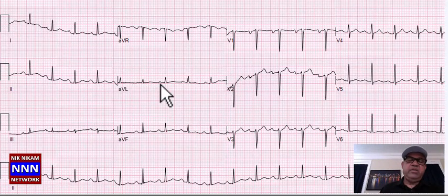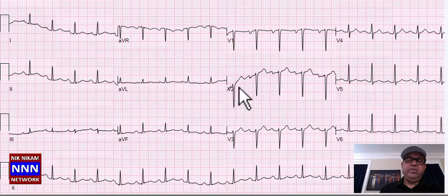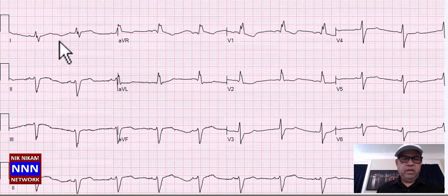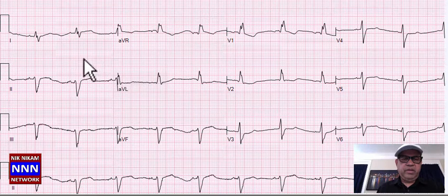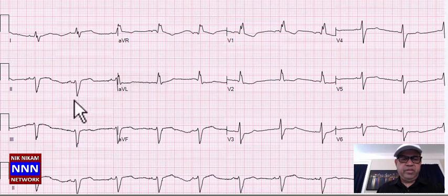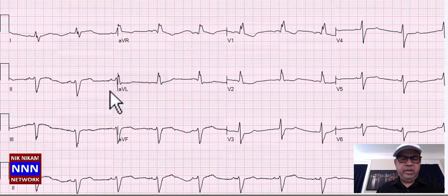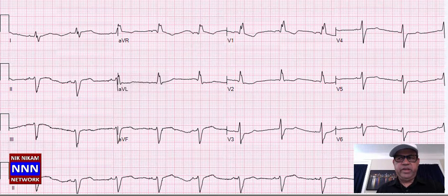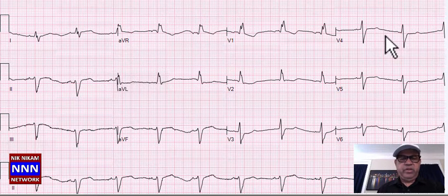Sinus rhythm with non-specific T-wave changes. Sinus tachycardia with non-specific ST-T changes.